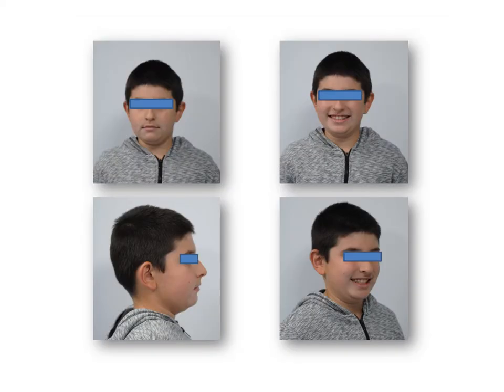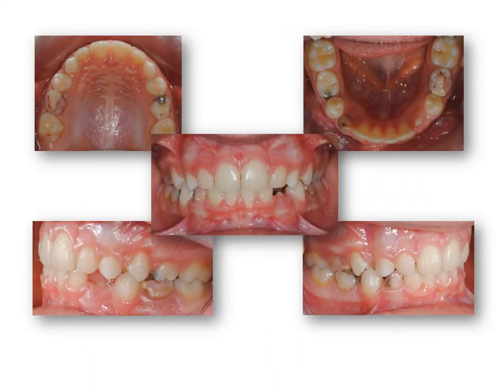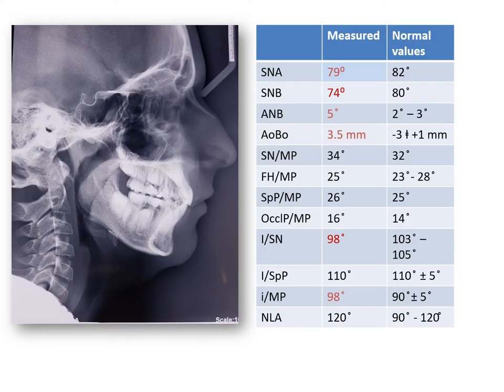And this is his smile and his profile after 1 year with this appliance, and the changes and the development of the arches. You can see that the incisors are not so vestibularly inclined and are perfectly aligned. The cephalogram proves the skeletal and dentoalveolar changes that we achieved during this time.